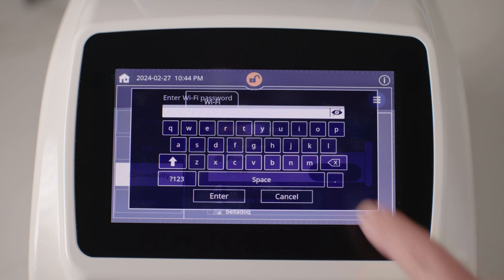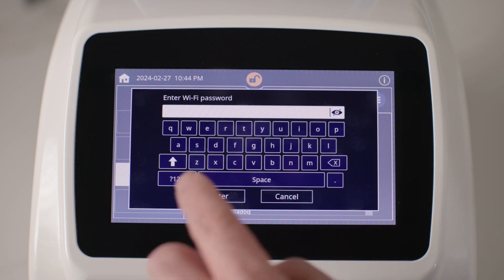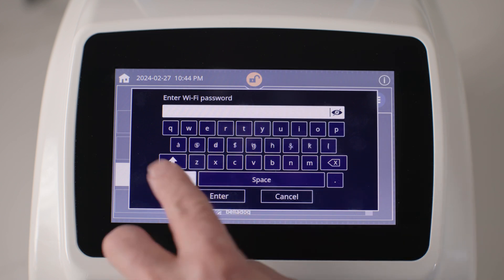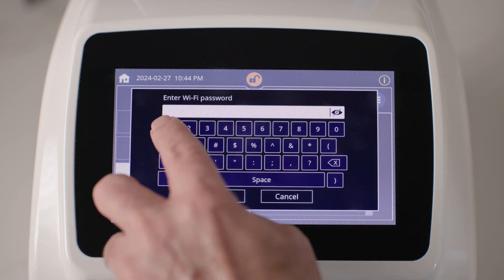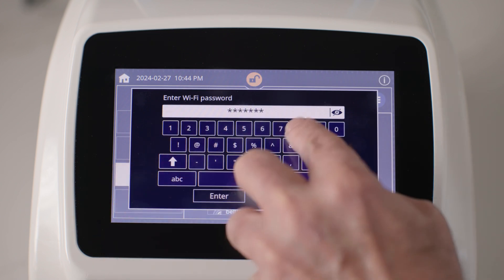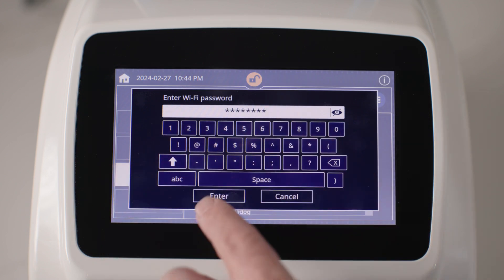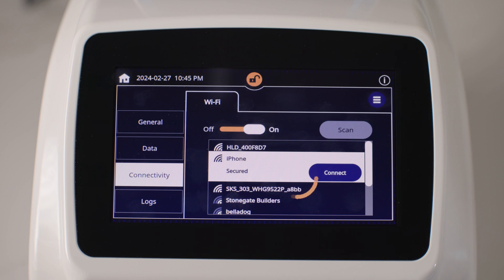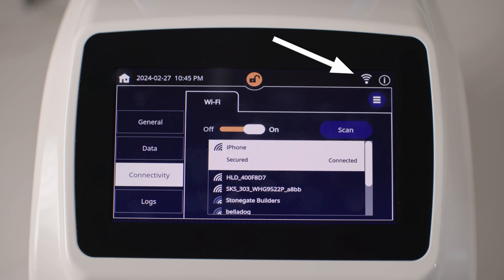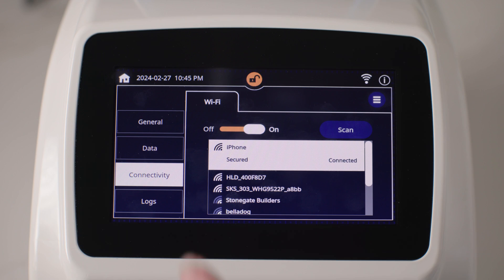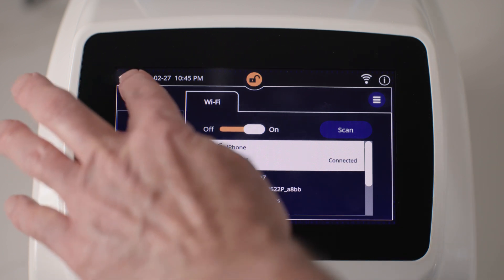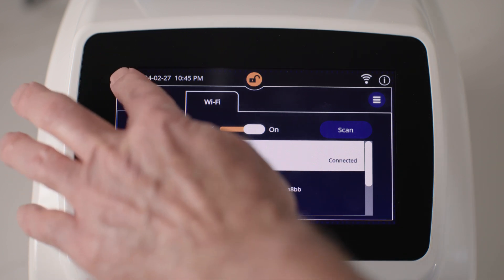If prompted, enter the Wi-Fi network password and tap enter. Once connected, the Wi-Fi network icon shows in the top right corner of the screen. Tap the home icon to return to the home screen.